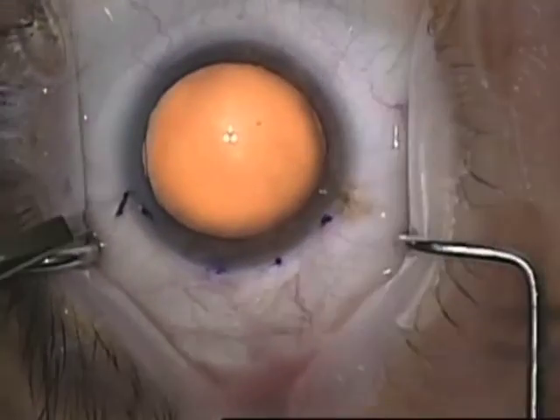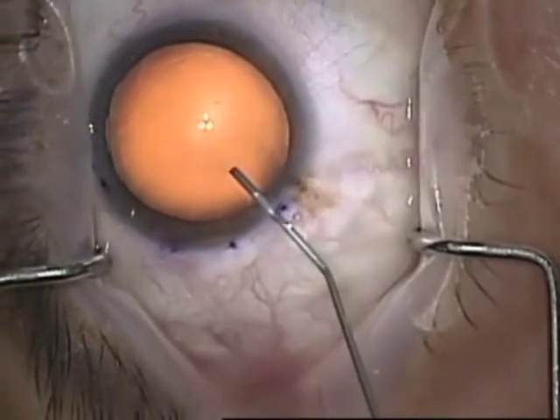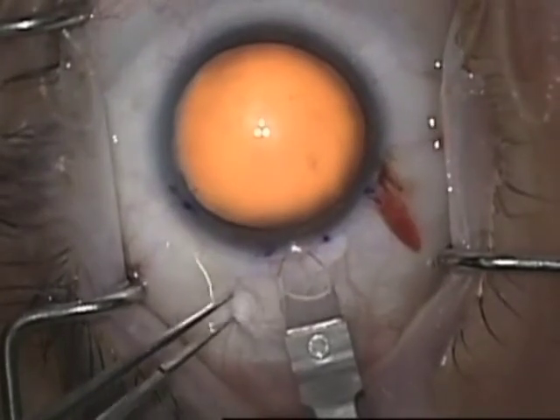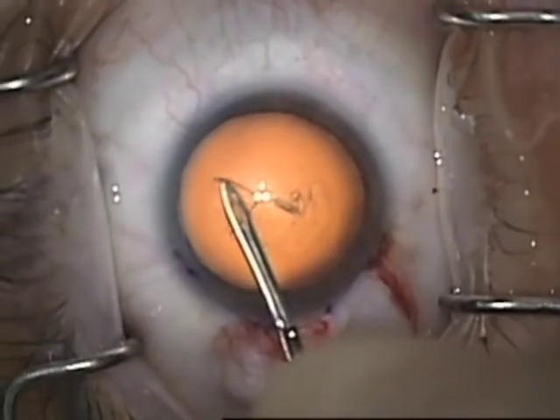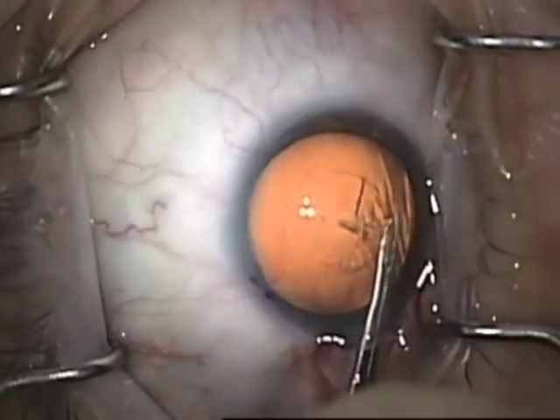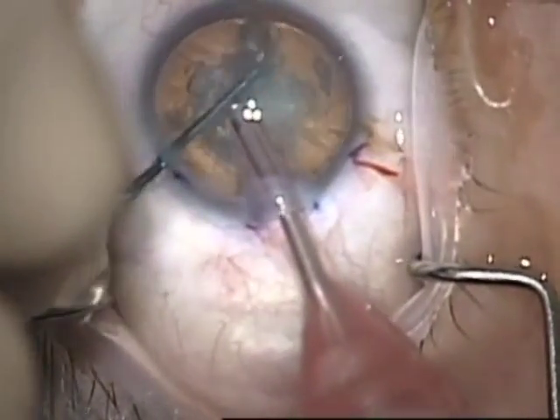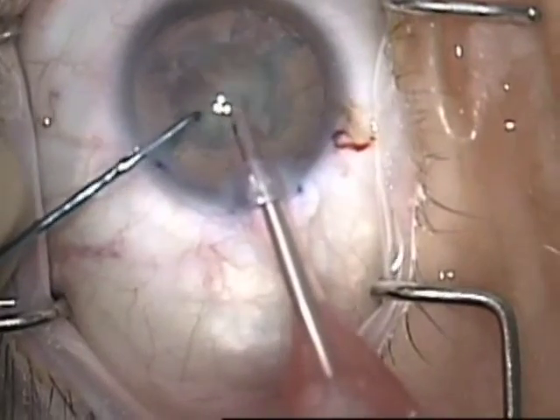I like to use 1mm side port incisions, made fairly flat so that they'll be self-sealing. I fill the anterior chamber with a cohesive viscoelastic such as Healon, then make a 300 micron groove — I feel this helps make a nicely sealing incision. Then I use a 2.4mm diamond keratome for all of my cataract cases. I perform a standard capsulorrhexis and keep it a little on the small side to keep the lens stable during the endothelial keratoplasty portion. I form a nice hydrodelineation and hydrodissection, then remove the lens using a FACO chop technique.